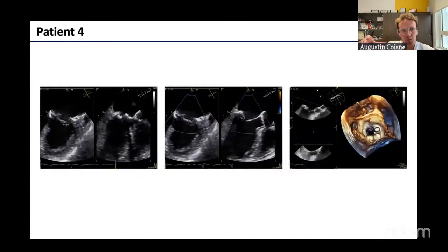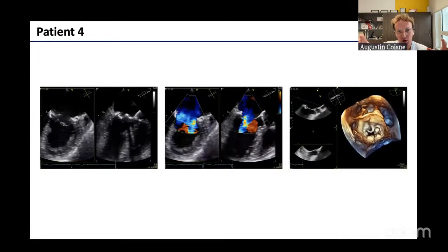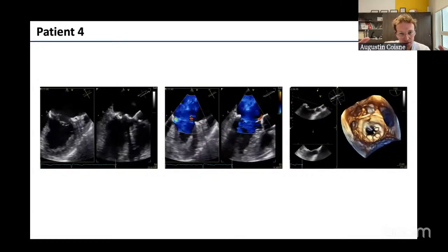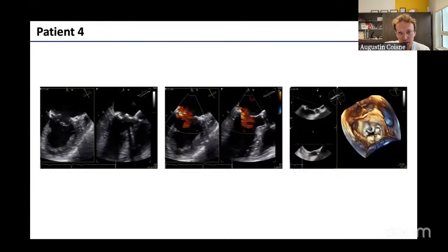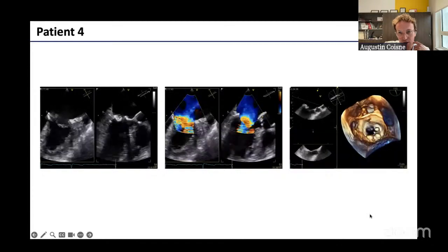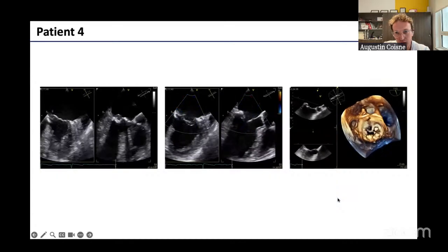And I wanted to present you this case once again. As you can see, it's a complex case because we had a degree of calcification. It's a MAC case, let's say, but not a calcification of the whole annulus. And within the calcification, at the posteromedial part, you can see a small prolapse with ruptured cords.